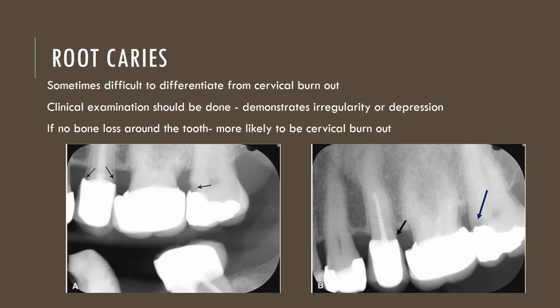When you probe the area and check, it should demonstrate irregularity or depression if root caries is present. If there is no bone loss around the tooth, then it is more likely to be cervical burnout. These images of a bitwing show secondary caries on the root surface, which is also visible on a periapical view. Root caries can be viewed on the second molar and in the premolar region on the periapical view as well.